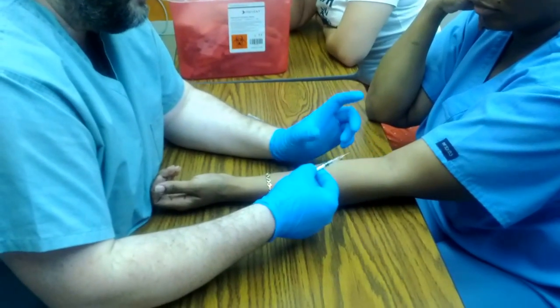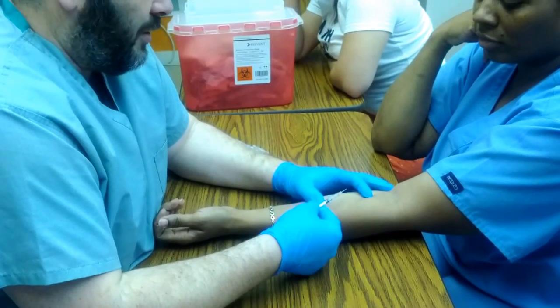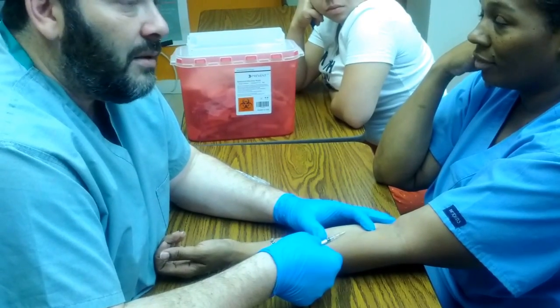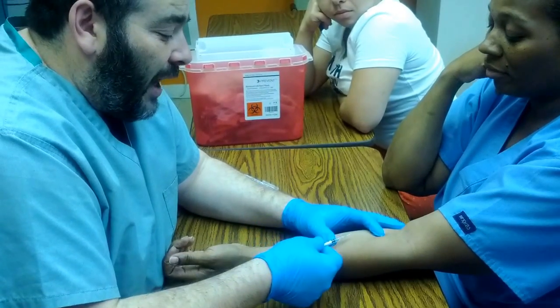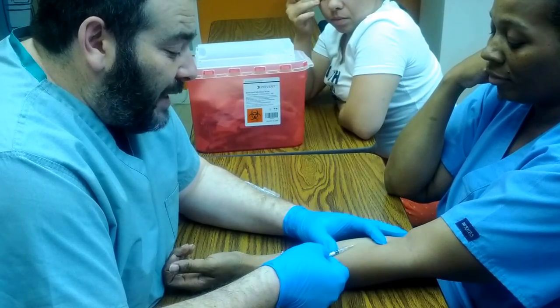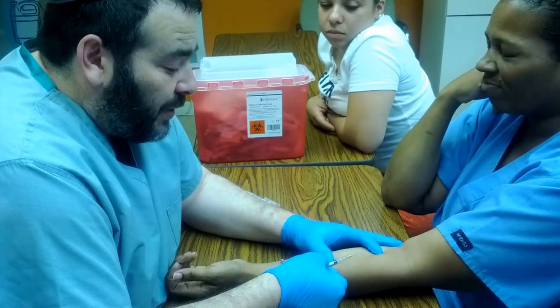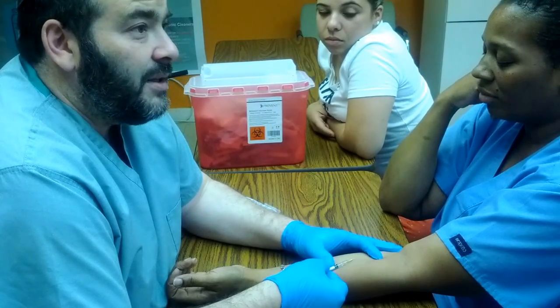Here's the important part of this injection. You take your left hand or non-dominant hand and you stretch the skin. Then all you have to do is lay the syringe down in the direction of the stretch, just like so. See how flat this is? I'm not going at an angle. I want to be flat, because we're doing an intradermal — or into the skin. Place it down just like so, and then press it, pushing the skin downwards. All you have to do now is move the syringe forward and stop as soon as the shiny part of the bevel has disappeared under the skin.